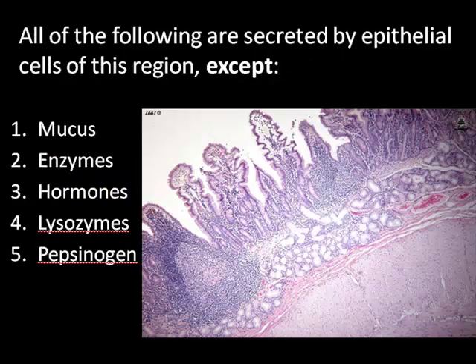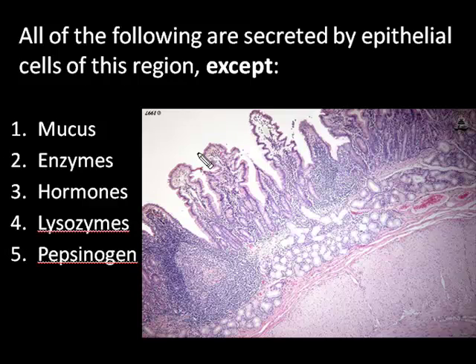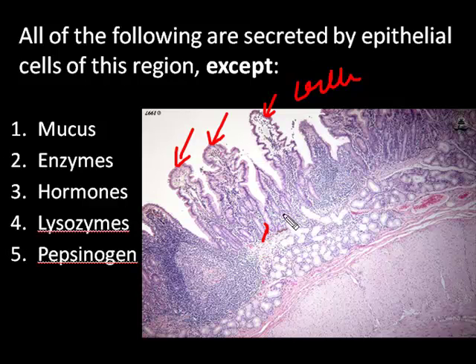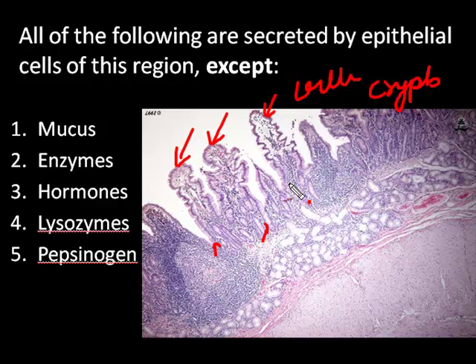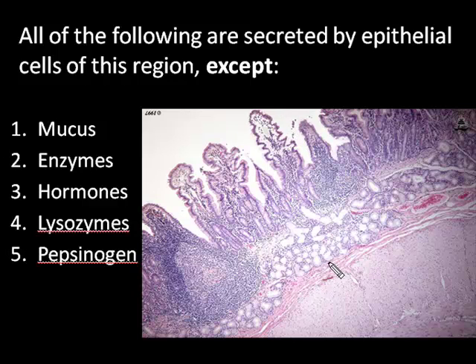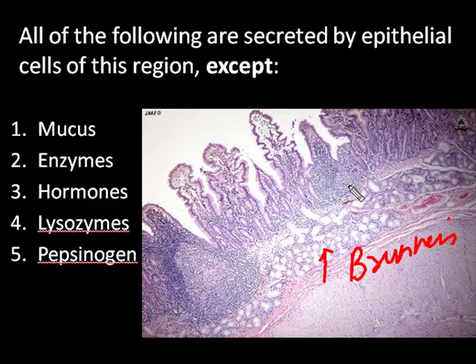The second question asks: all of the following are secreted by epithelial cells of this region except which one. First let's identify this region. You can see these finger-like projections — these are villi — and then you can see invaginations going in, which are called crypts of Lieberkühn. Therefore, this is a section taken from the small intestine.